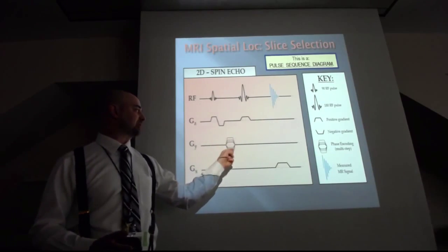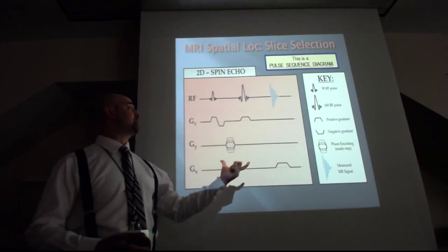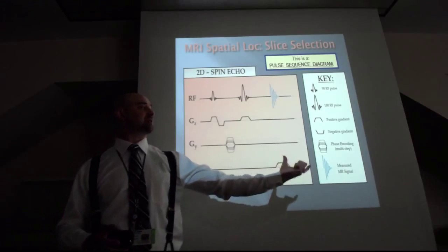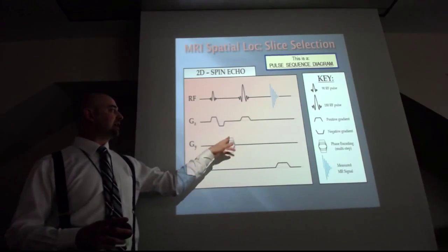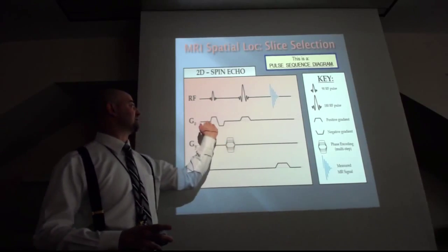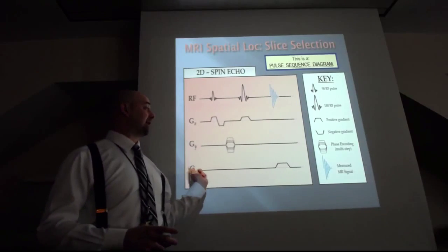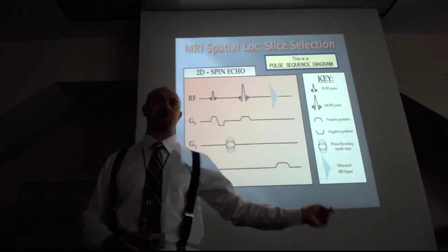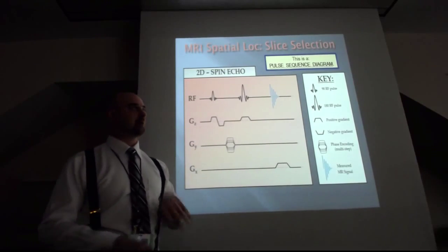The reason this looks like a step ladder is because when you take an MR image, you repeat this pulse diagram multiple times. And at each one, the value of this gradient changes, whereas the value of this gradient stays the same, RF pulses stay the same, and our final gradient in the x direction, our read gradient or frequency gradient, stays the same. That was a crash course.